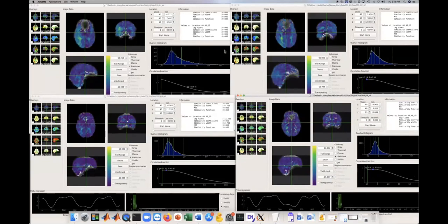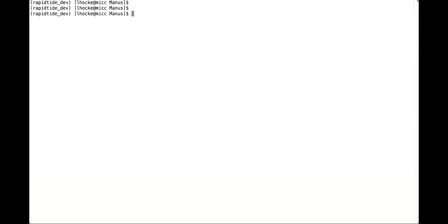And lastly, if you check the regressor again, we see now that pass 1 has the low-pass filtered version of the Carbogen challenge. So we are taking this information into account now. As I said, the width of the histogram is hard to compare with eyes, but you can also plot them on top of each other.